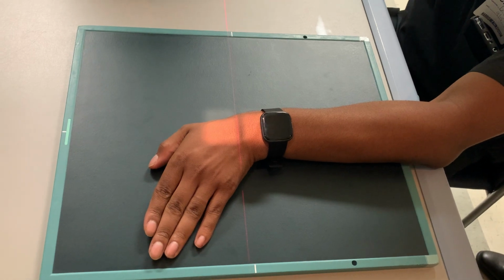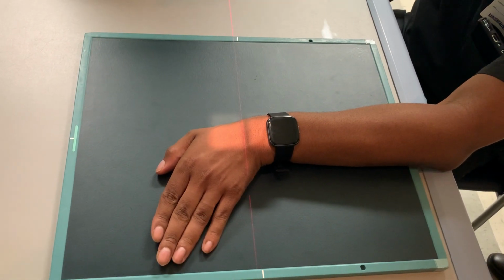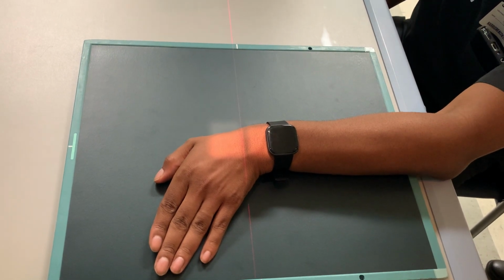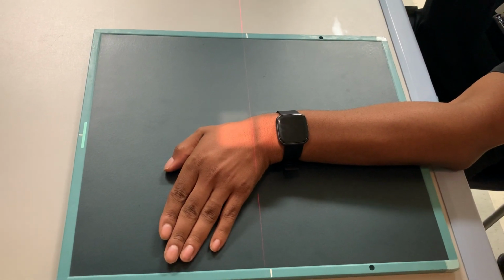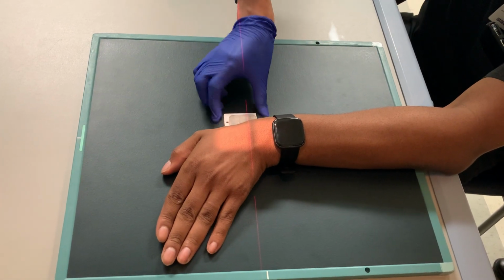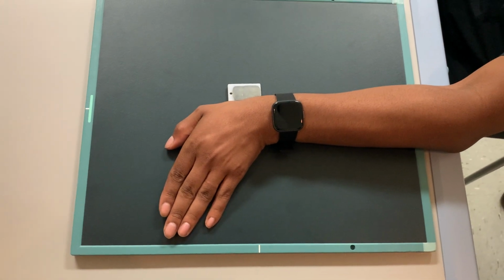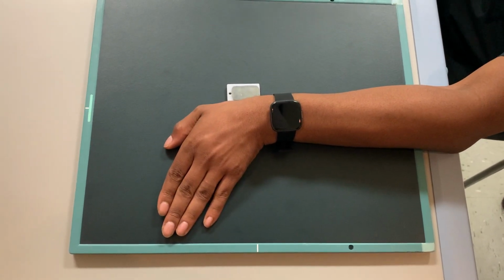Okay. Which marker are we going to use? Left. The left. Very good. This time it's the left marker. How is it going to be placed? Here. PA, and on which side? Thumb side. Okay. So that's going to be our left marker for the ulnar deviation wrist. All right.